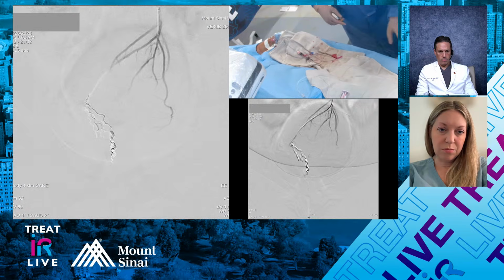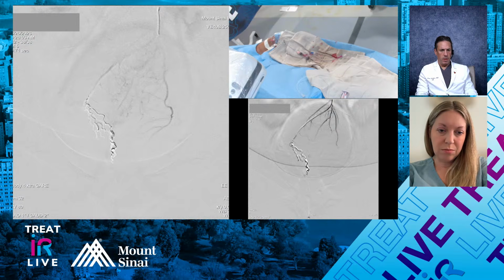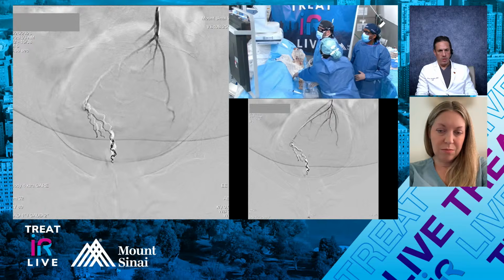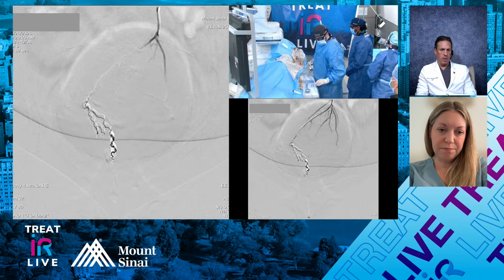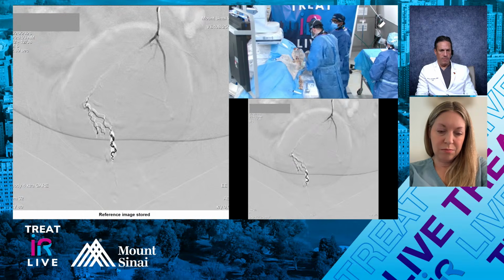The nice thing about radial access, Dan, as you guys know, is that you can put that base catheter pretty far into the IMA if you need to, particularly if it's like a vertebral shape or Burn shape that allows you to sort of drive it over the microcatheter to get a little extra purchase if you need it. You don't have to.